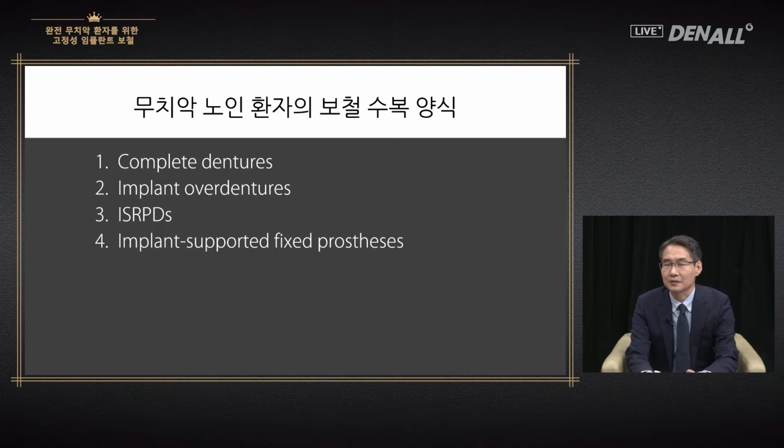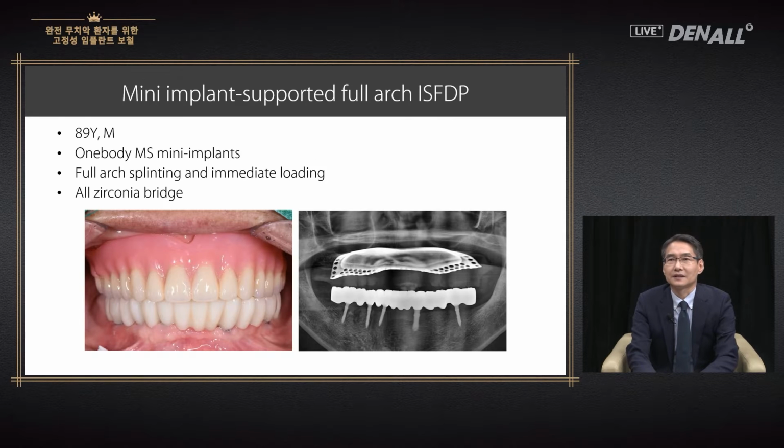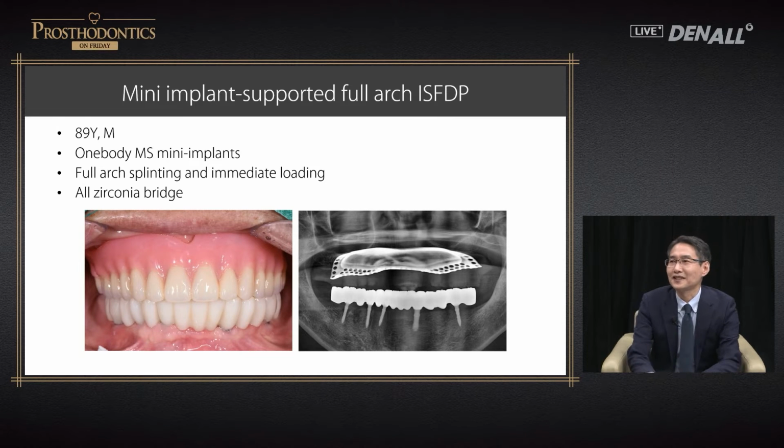Although they may all be fully edentulous patients, depending on treatment method, patient satisfaction and discomfort can vary significantly. This is a drastic example, and this may be difficult to swallow for some people. This male patient was 89 years old at the time.